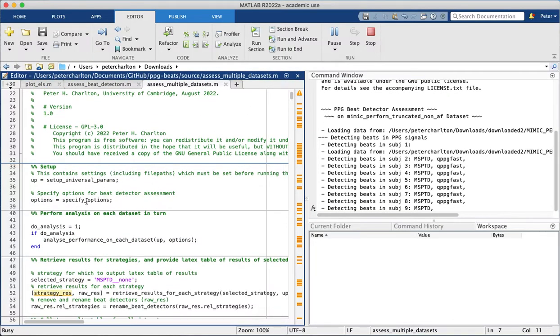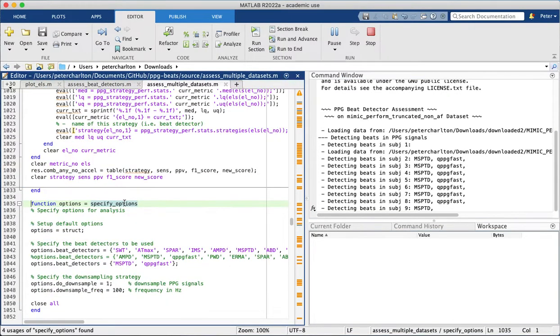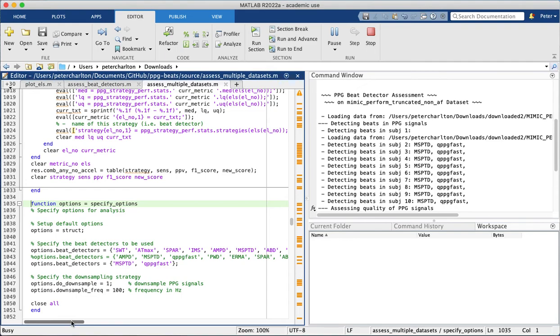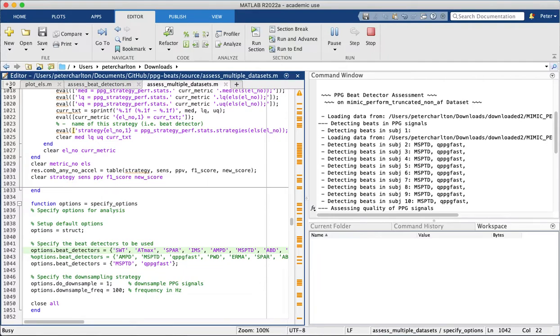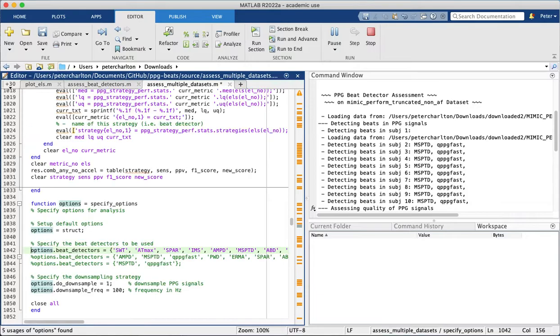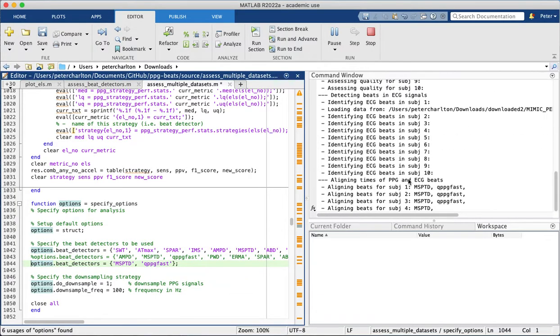Now these were specified in this specify options function, and there are many more beat detectors that we could use. So for instance, if you wanted to assess the performance of lots of beat detectors, then you would comment out that line and you'd have all these beat detectors here. But just for speed, we've used these two.